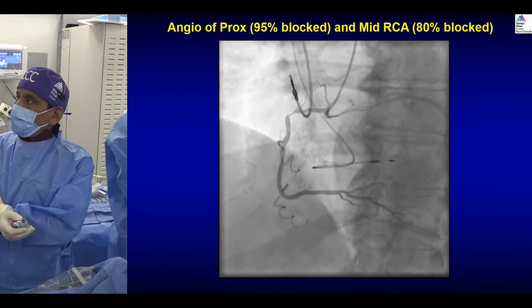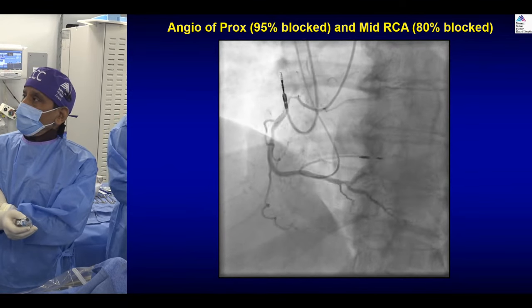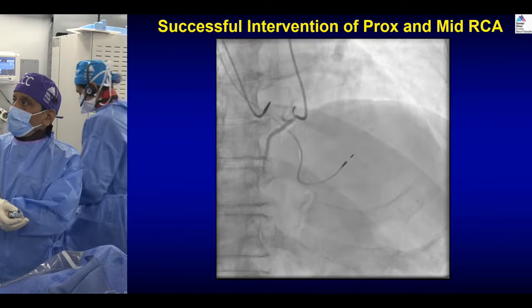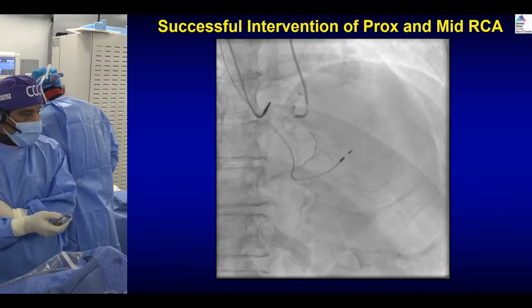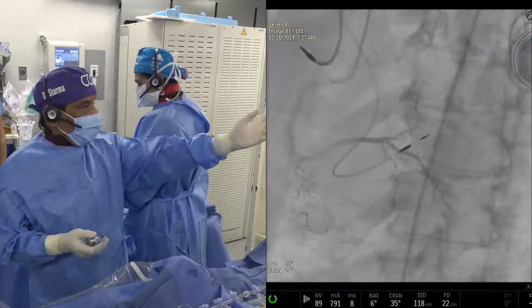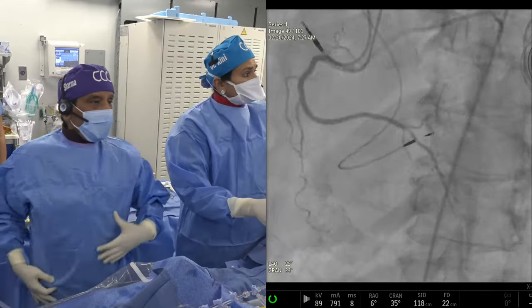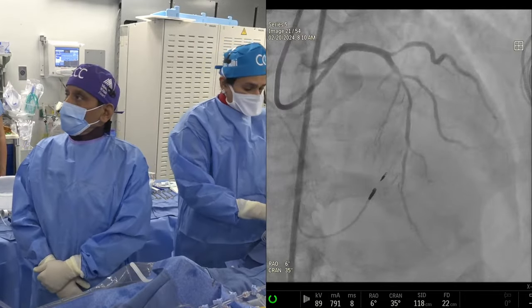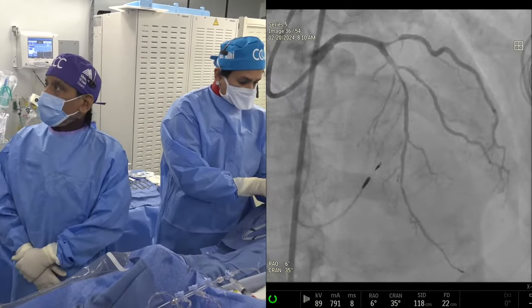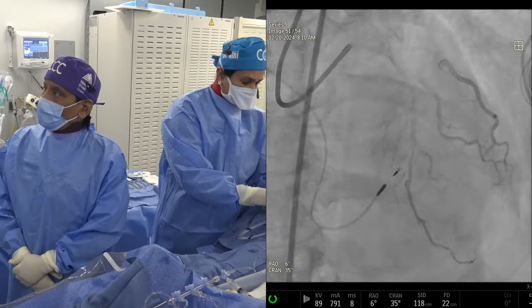The right coronary was this, one lesion and the second lesion. And you see the anomalous circumflex right there, which was okay. And we put two stents in the right coronary. Patient did fine. And now here for the LAD, you can call it a left main because there's no left main. LAD and two bifurcation lesions of the two diagonal branches, which are good size. See that? First, the D1 is the large size, about 3 millimeter, and then the D2 about 2.5 millimeter, and the mid segment is calcium, but not that much calcium.